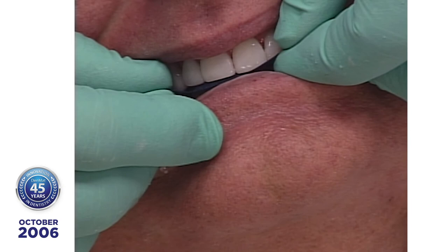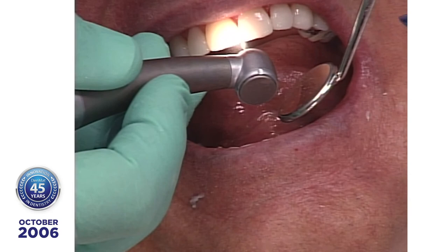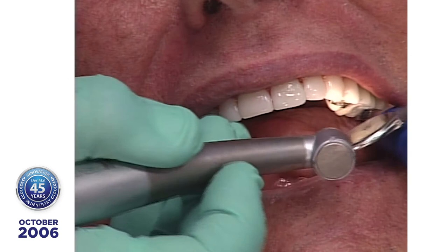Check the occlusion. Close. Grind around. Open. And most of that's on natural tooth structure, so I'm going to take the football-shaped diamond, remove a little off the top on the lingual side, and then I'll come back to the lowers, get those teeth together. You want to make sure you don't have any heavy contacts on the porcelain.